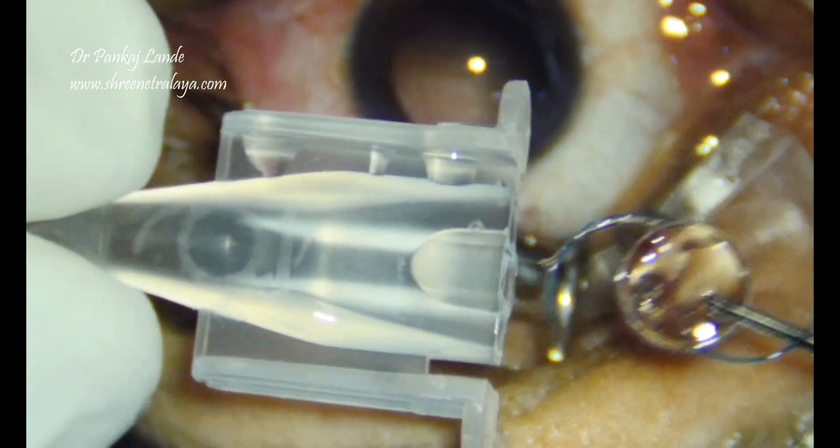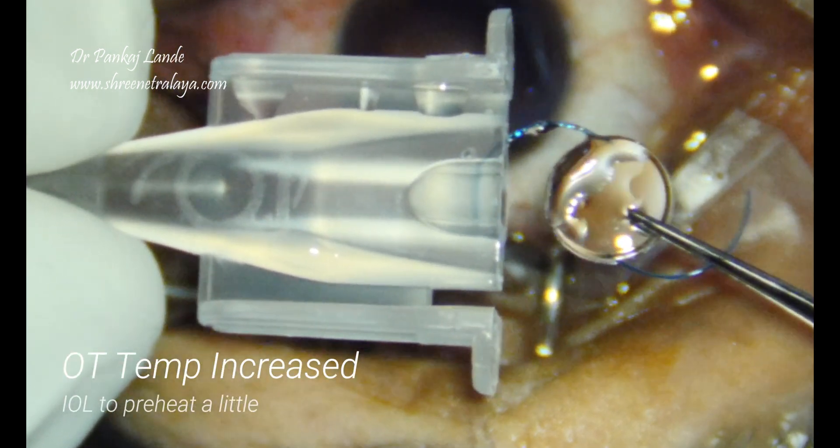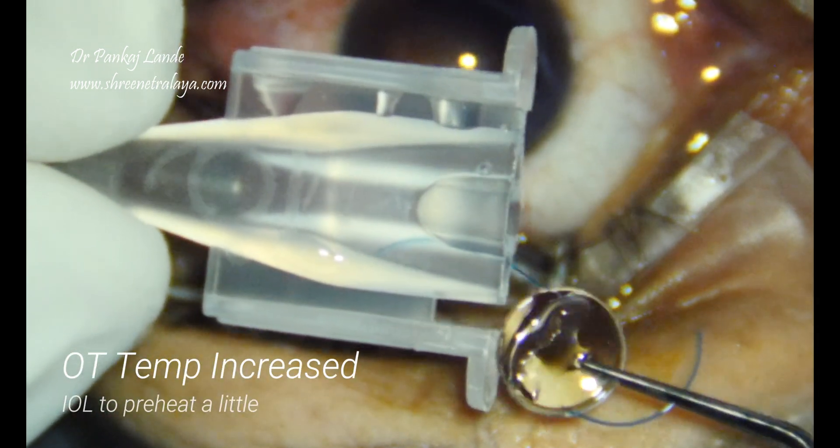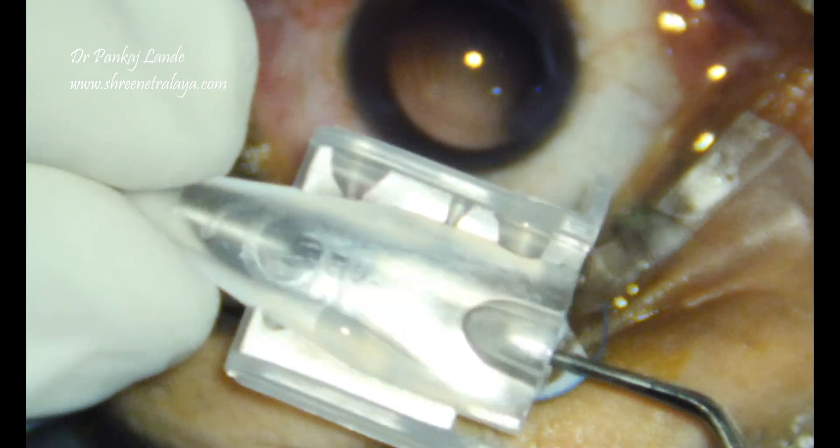Now I have taken the IOL. I have made sure that my AC in the room is off, and before implantation the IOL is slightly more malleable with higher temperature.